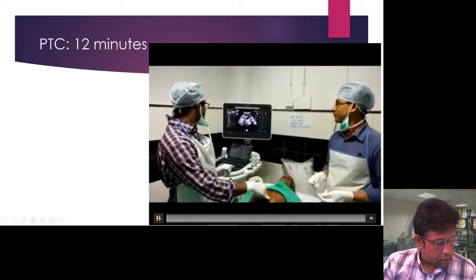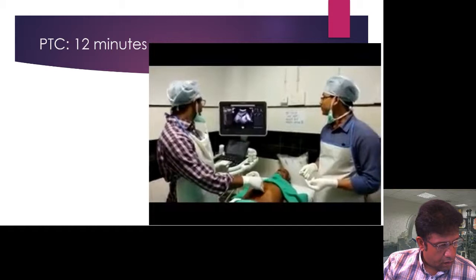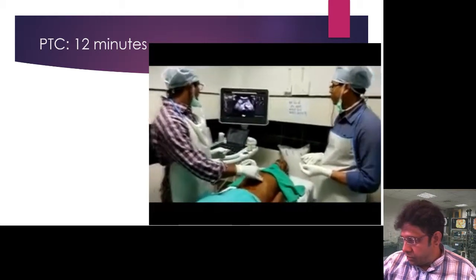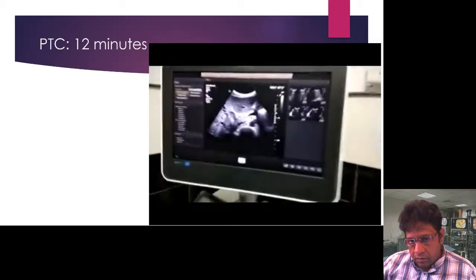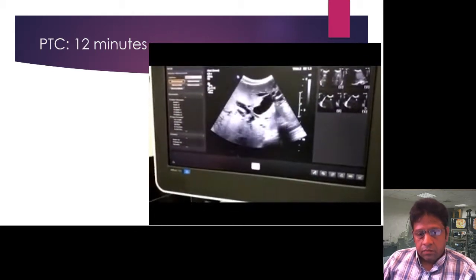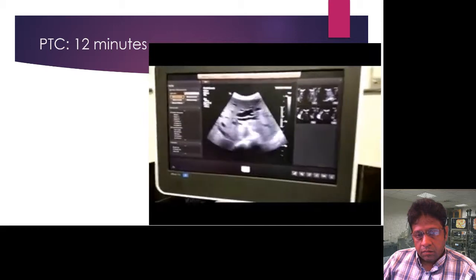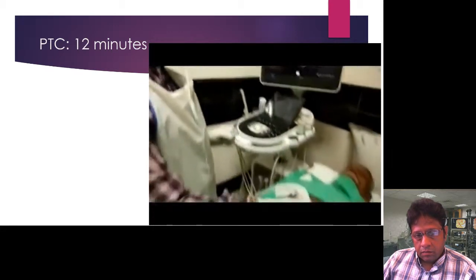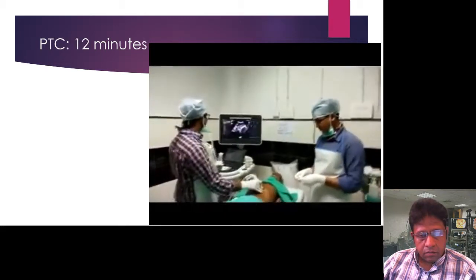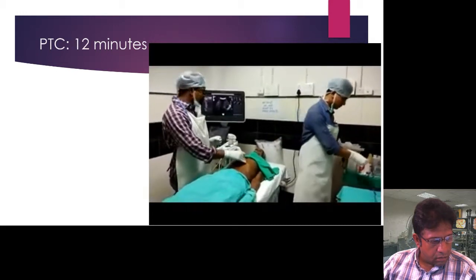This case followed previous stenting, and was a case of gallbladder neck carcinoma with local infiltration in the CBD, leading to dilated biliary ducts, as we can see. While selecting the patient for the PTBD procedure, proper scanning of the patient is necessary, and we assess both the hepatic ducts, right and left, and preferably we do the PTBD in the left hepatic duct. It's better to do the scanning from the mid abdomen and the midline, right from the sternum area, and look for the dilated biliary ducts. So here we will be showing you how to do the PTBD in a very easy process.